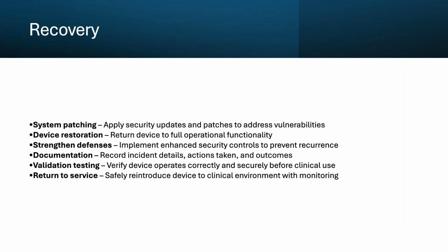We watch for anomalies, unusual network traffic, or performance issues. Recovery isn't complete when the device is turned on. It's complete when we're confident it's both clinically effective and secure. The key takeaway is recovery from embedded operating system vulnerabilities requires a methodical, safety-first approach that balances clinical needs with cybersecurity requirements.